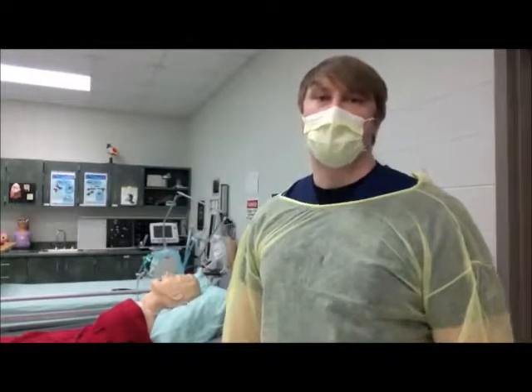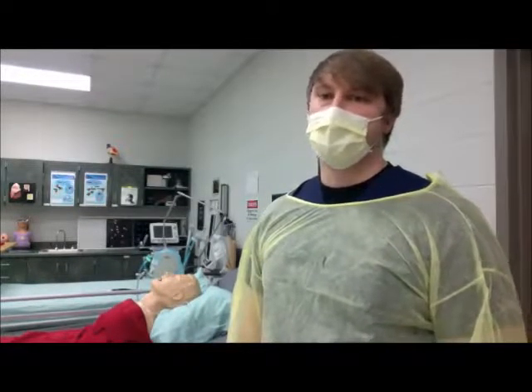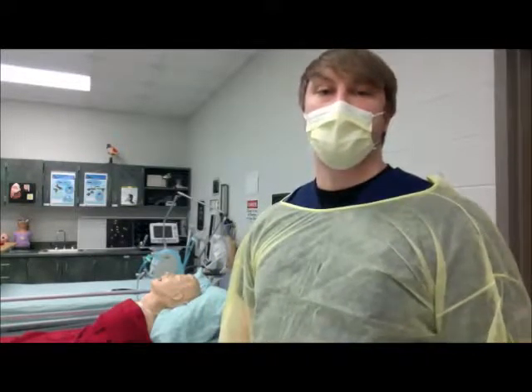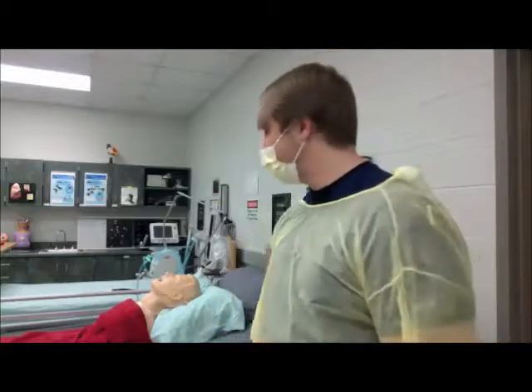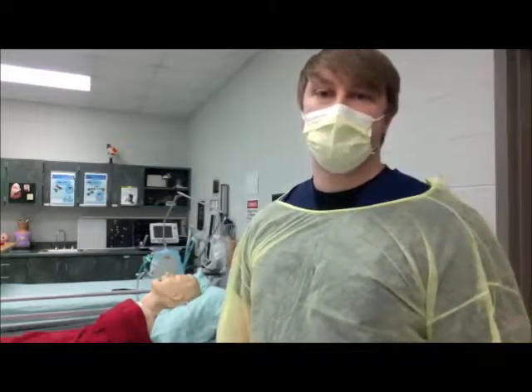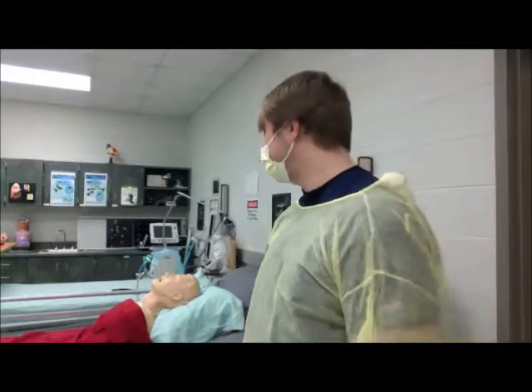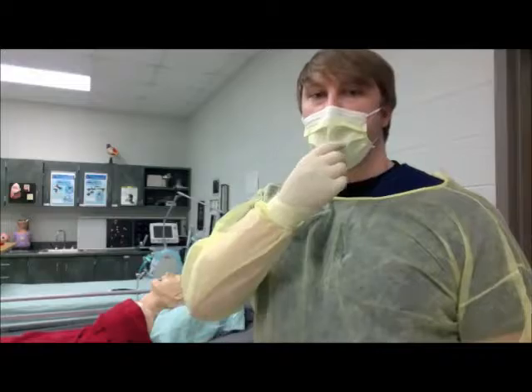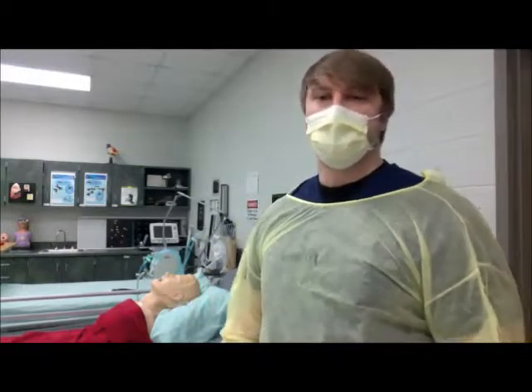Update on Mrs. Tubbs. She has finally passed her weaning trial and she has successfully been extubated. Now she is currently on 2 liters of nasal cannula, but almost immediately after I extubated her, she's starting to desat down to about 82%. She's becoming tachypnic. So after assessing her, she's performing a rapid shallow breathing technique.